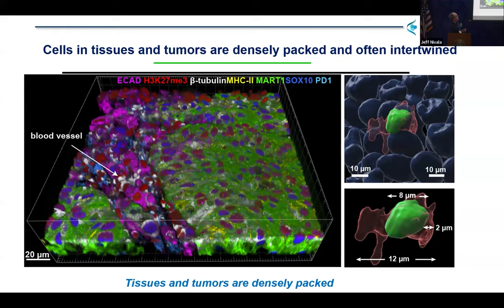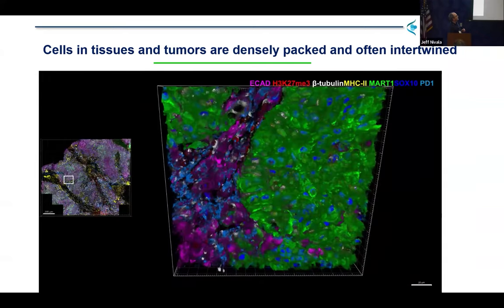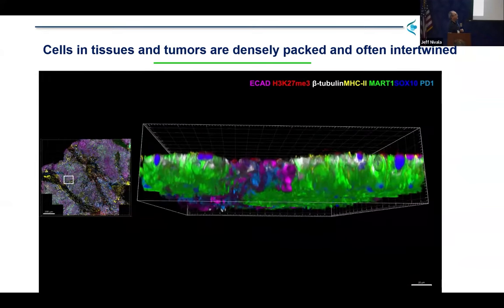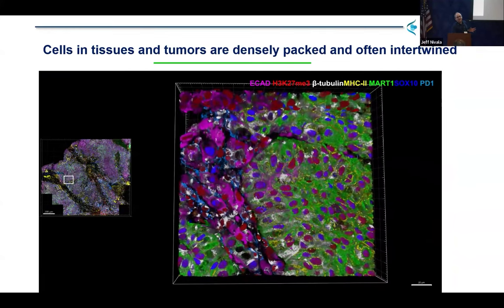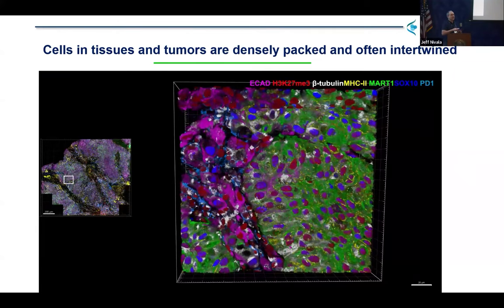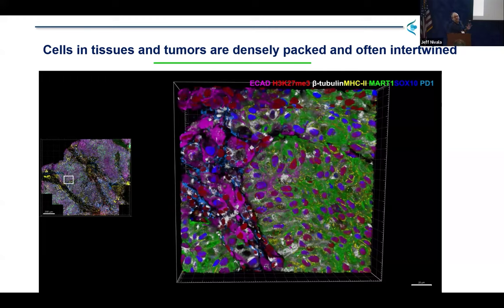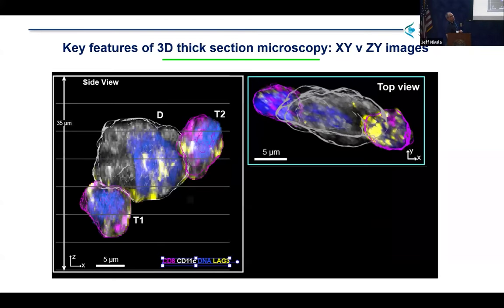We've also learned just how densely packed tissues are. Here's another example where we've taken all channels — this is a region of an invasive melanoma — and we find the average distance between cell membranes is less than a micron, and cells are very frequently stacked on top of each other. One of the problems that single-cell spatial transcriptomics and all protein methods face is adequately segmenting one cell from the next. Most algorithms are based on machine learning, but this is a fundamentally difficult problem when dealing with a two-dimensional projection of a tissue slice.